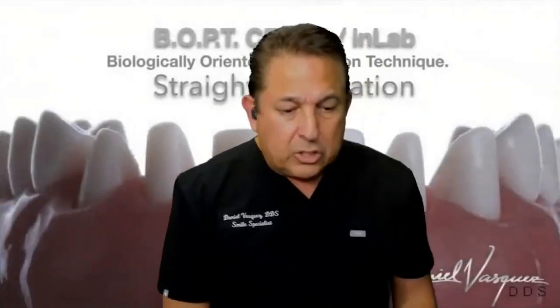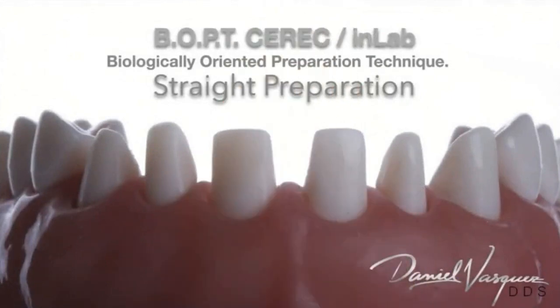So I'm a fan of the BOPT technique. I'm going to show right now another case made on models, and why I like this technique. BOPT is the biologically oriented preparation technique, and what it does is train the soft tissue. If we want to increase the height of the gingiva, we don't need to do surgery. We'll increase it by pushing the tissue more gingivally, adding more ceramic on the margins, so we can actually train the soft tissue.